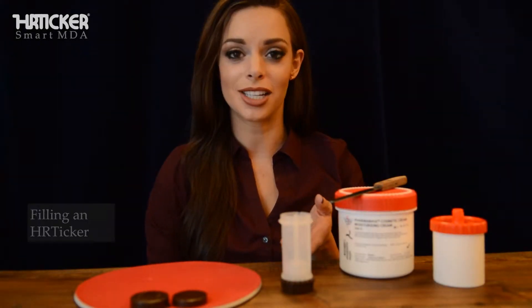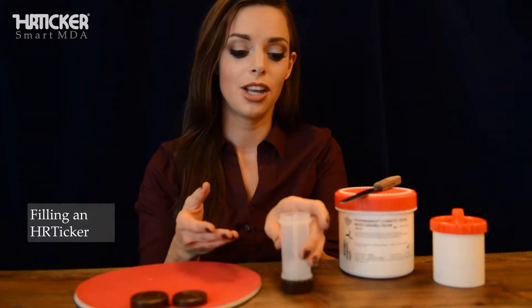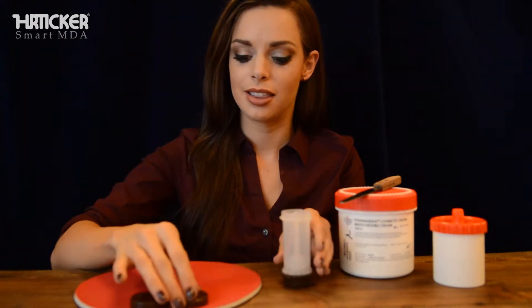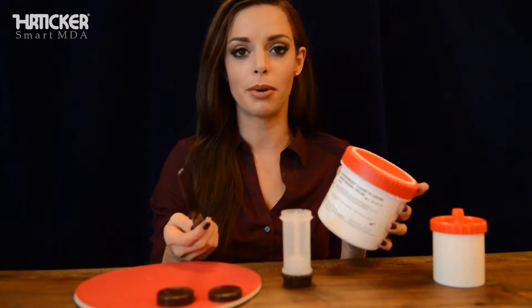Allow me to show you how to fill the HR ticker. This is exactly how you receive the HR ticker from the manufacturer. You'll have the dispensing unit, the dispense cap, and the safety cap. I'm just going to show you using this pharma-based moisturizing cream by Phagron.